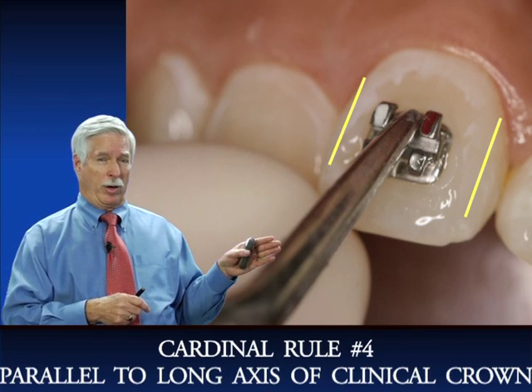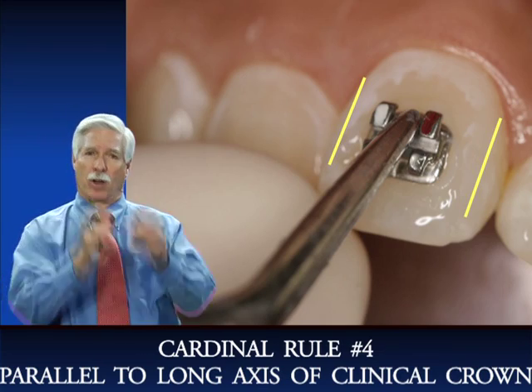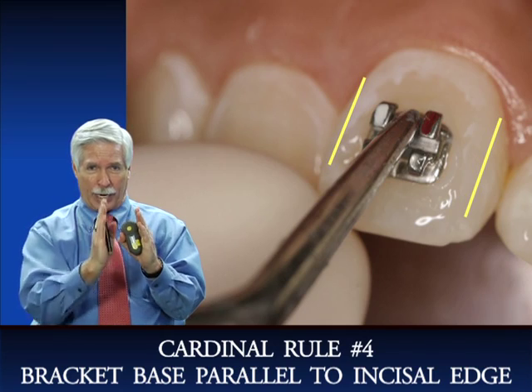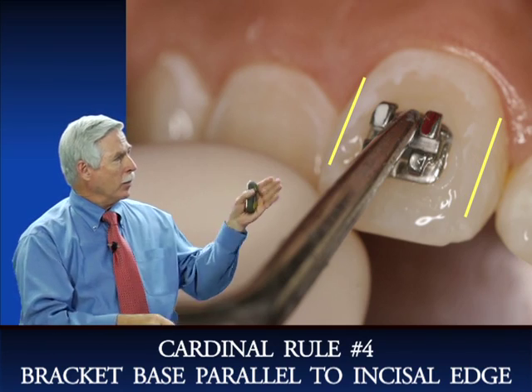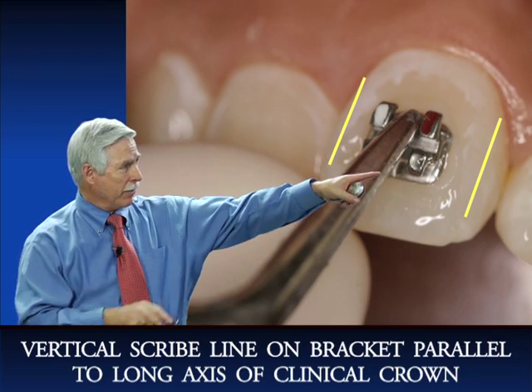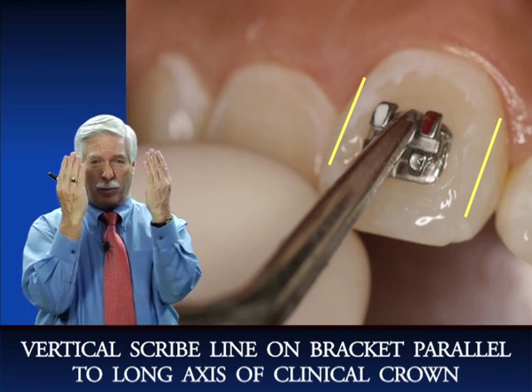Cardinal rule number 4 for bracket placement is the bracket must be placed parallel to the long axis of the tooth. So find out the long axis of the tooth and place that bracket parallel to the long axis. Okay, so there's usually a scribe line right down the middle of the bracket, which is being covered up by this college plier now, and you can line it up. Also the wings of the bracket.